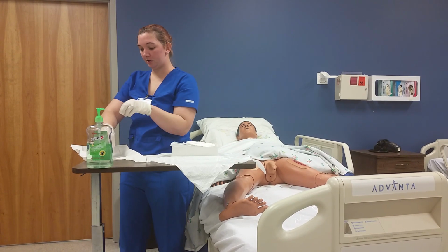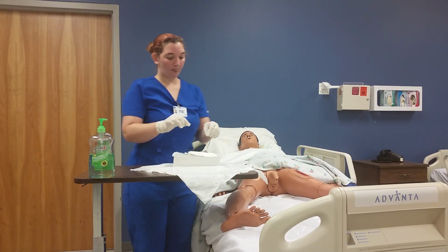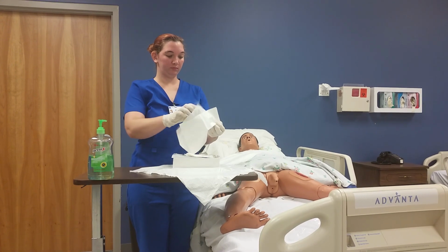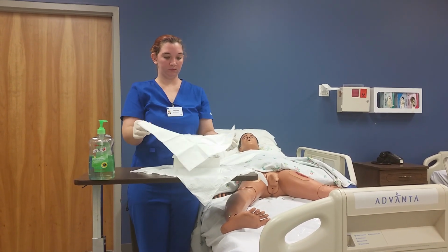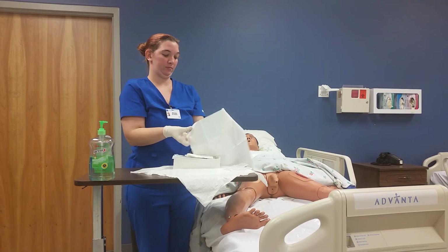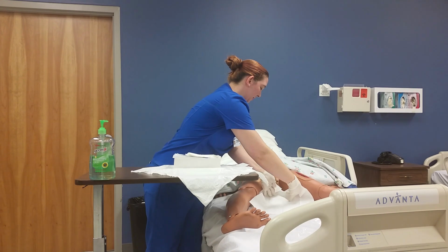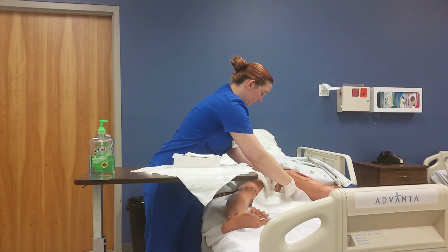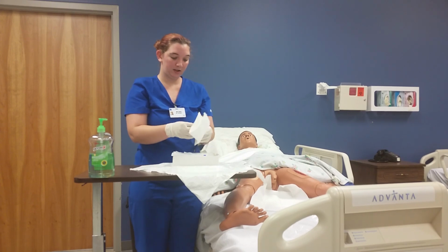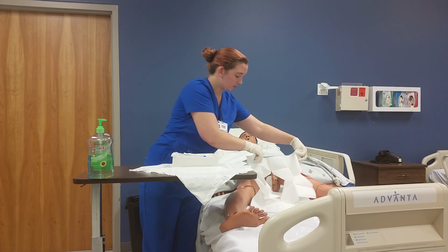Since the outer edges are dirty, I'm going to grab it right in the middle and get rid of it. So now I'm going to take this out. I'm going to put the shiny part down. I'm going to fold it in, making sure not to touch the patient. I'm going to take this one here. We're going to open it up, and we're just going to drape it over in.